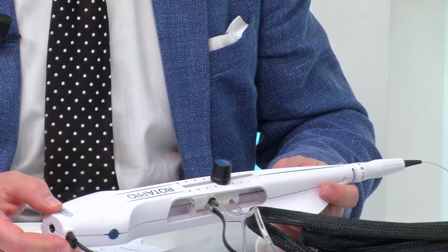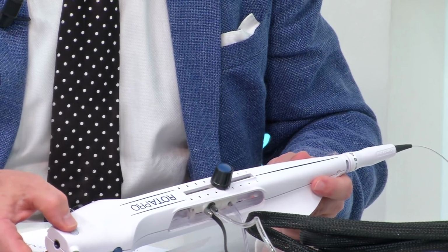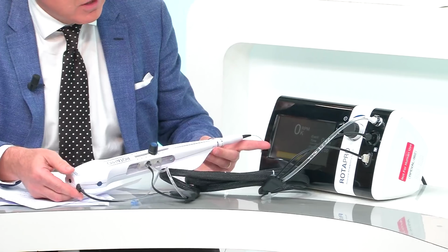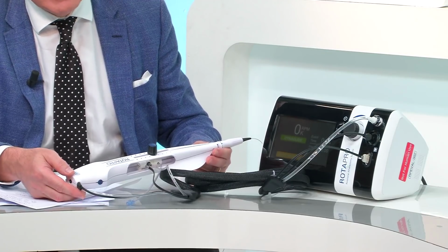Second modification, second button. This is the DynaGlide button to switch from the normal way to the DynaGlide mode. It's just over there. So you press. Here you will see on the screen that the DynaGlide disappears, because I was on the DynaGlide mode. But now I repress on it like this, and you can see immediately that DynaGlide has been activated. So easy also to activate. You don't need to have this small pedal that you had on the right side by your feet.